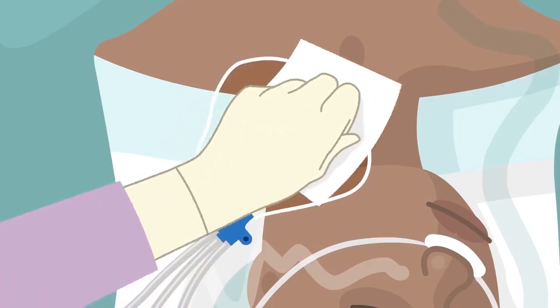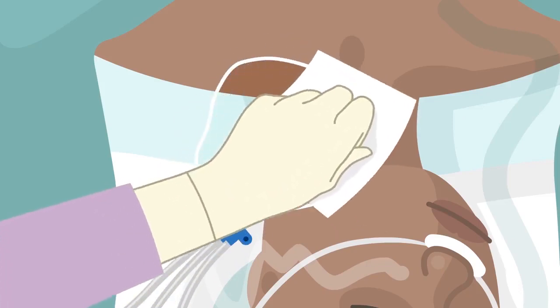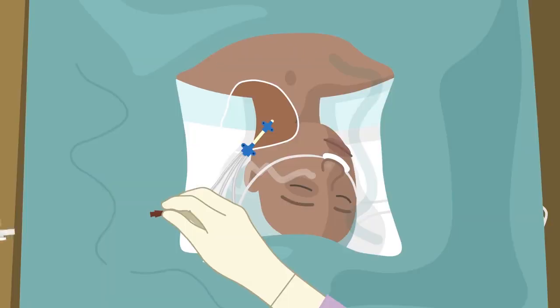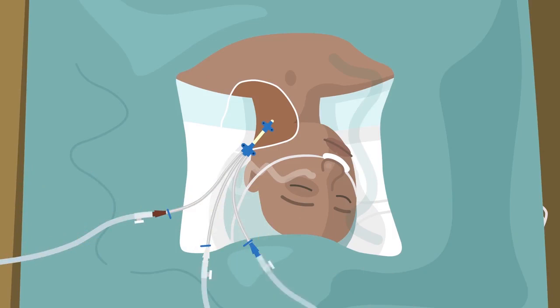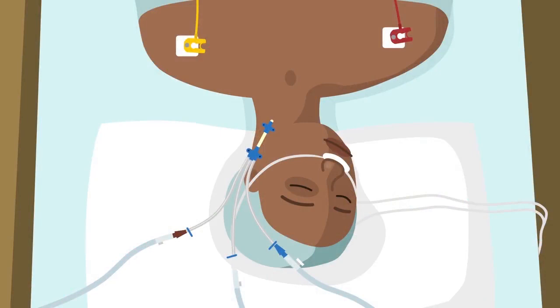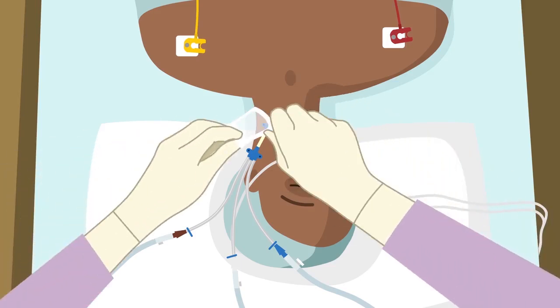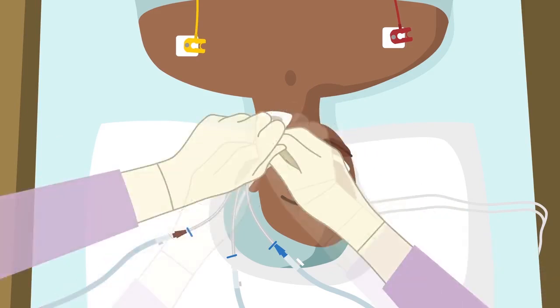Catheter and insertion site are disinfected using alcohol-based chlorhexidine or an equivalent disinfectant for skin antisepsis. The tubes are connected to the catheter and the drapes are removed. In case tissue drapes are used, drapes must be removed before connecting the tubes. Sterile gauze and adhesive dressing or transparent adhesive dressing, whichever is available, is applied. Make sure to avoid air bubbles or fluid collection.